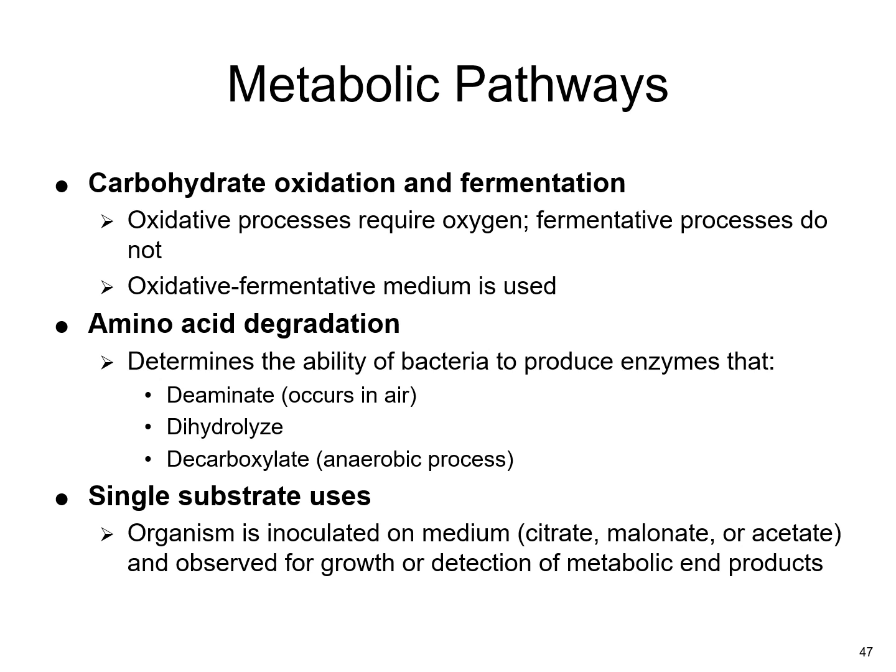Some of the additional tests that are performed look at the different metabolic pathways, and this is whether or not they perform an oxidation process or are able to ferment certain sugars. You will get more detail on this as we get later into the bacteriology unit.